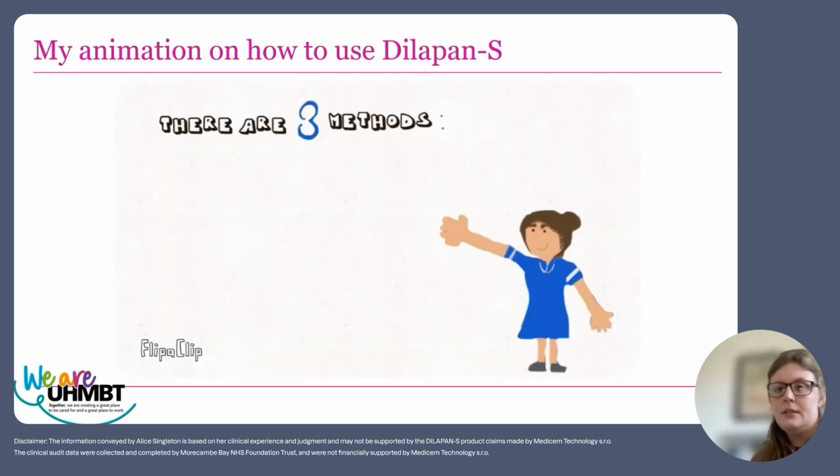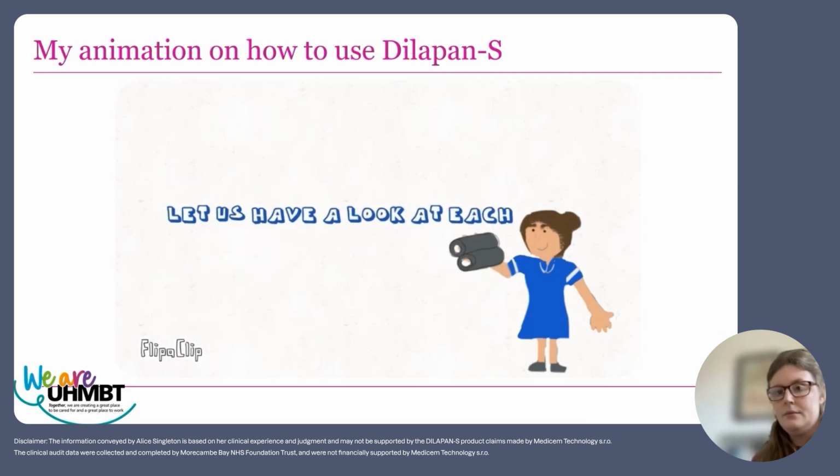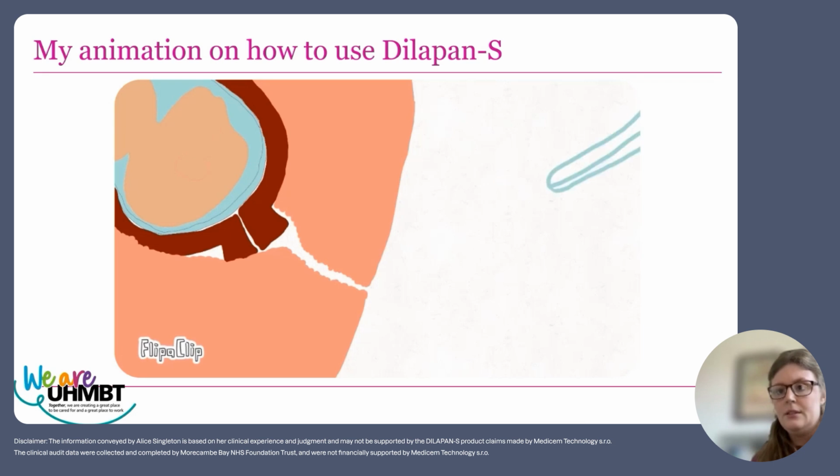So there are 3 main methods. You can use a speculum, you can do it digitally using sponge holding forceps, or you can do it completely digitally and use your fingers to push up the Dilapan. So let's have a look at each of these methods in a little bit more depth. First of all, we're going to talk about using the speculum.